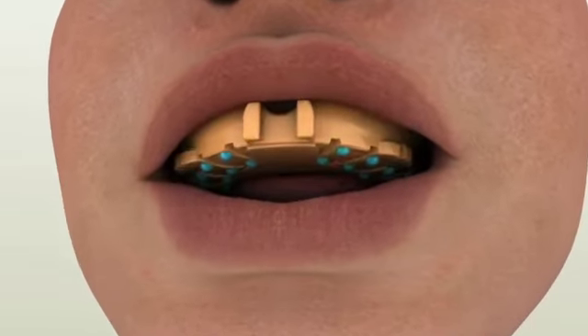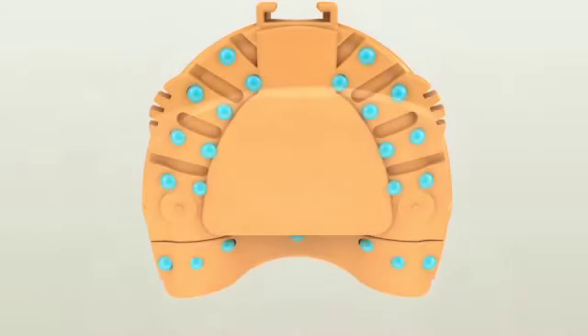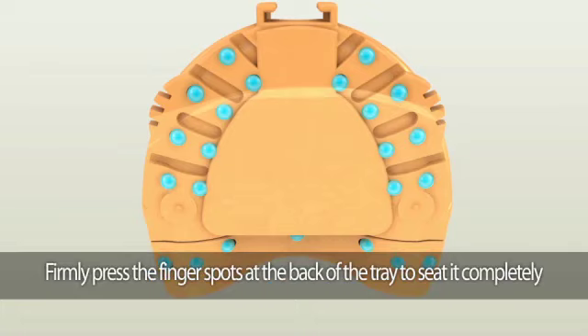Carefully insert the tray into the patient's mouth to help with the complete seating of the customized Pala digital denture tray. There will be finger spots on the back of the tray that allow you to apply pressure in the correct position. Firmly press the finger spots at the back of the tray to seat it completely.